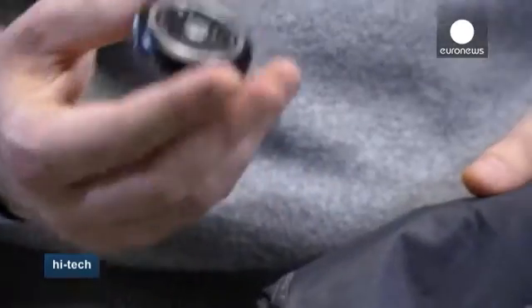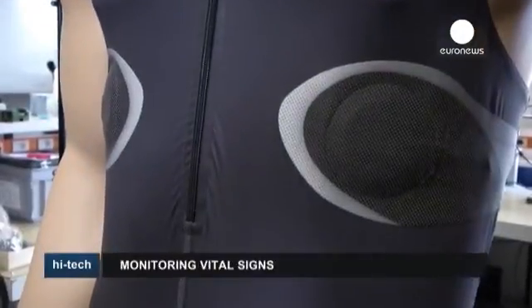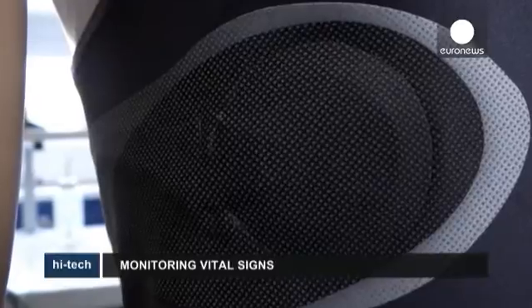Once the sensor is ready, it can be used in many ways. These mannequins display special triathlon suits complete with in-built sensors which can be worn during cycling, swimming and running, but which can also monitor the athlete whilst they sleep — an important parameter.